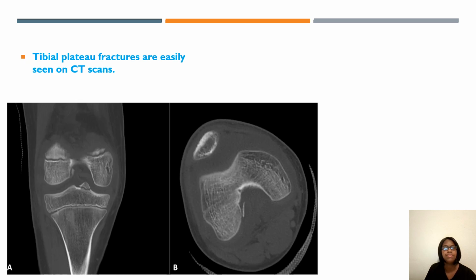We have your knee. Whenever your knee is ordered, mainly probably for fractures, dislocations. Just know how much to cover. Be careful whenever you are scanning a patient's knee. Make sure that you are being careful whenever you do have to move them, especially if they have a fracture.